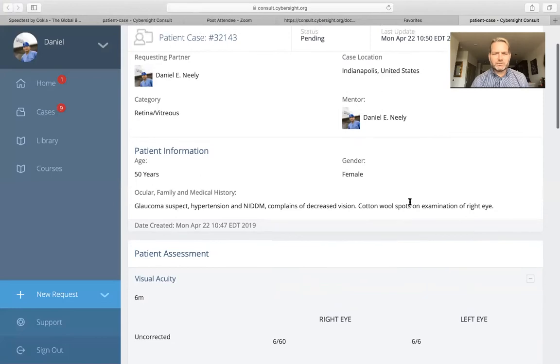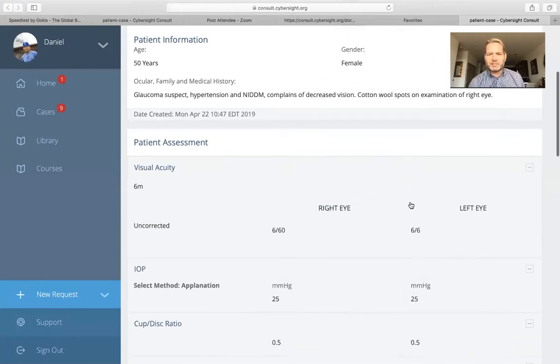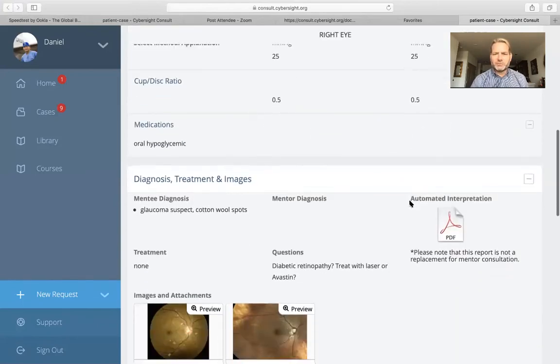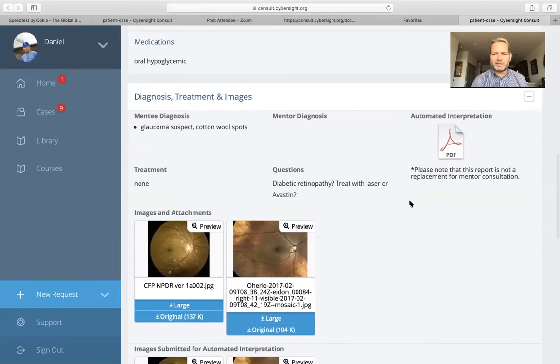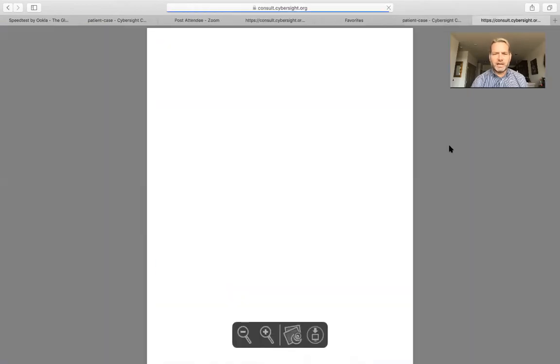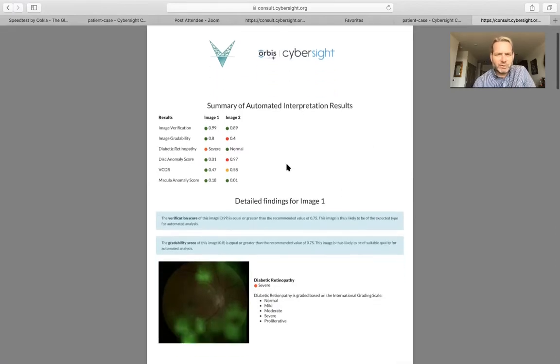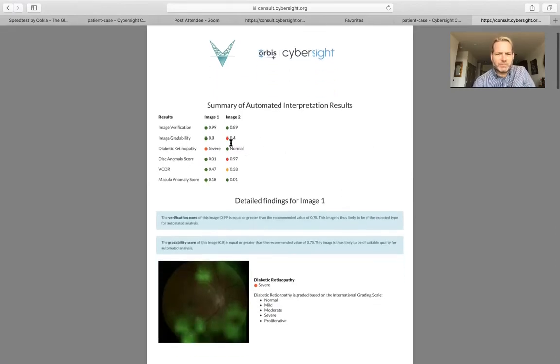Here's our case with the glaucoma suspect, non-insulin-dependent diabetes, cotton wool spots, and examination findings. As we scroll down, we'll find that a PDF report from the Visualytics software has been attached. Opening that up, we can see several condensed results at the top. The first two are image quality and image gradeability, and we want these numbers to be quite high — close to one, like they are.